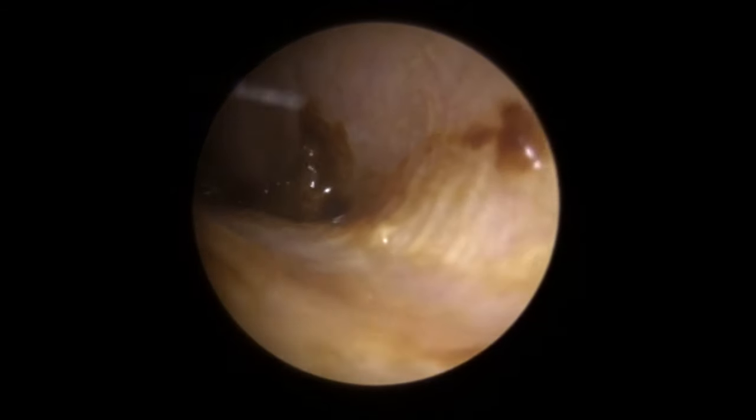So we have to go back in now with the Jobson horn. Crash zoomed it straight into the camera — there we are. You can see now we've got another really long block of wax — look at that. It's almost the full length of the ear canal again. Very, very dry in nature. There's a little bit here left at the entrance to the canal — so just take that away. And then we've got this last section — you can see as with the other ear, it's broken a section off really deep in the canal. So we'll go get that now — just got to tidy up around the outside edge first.